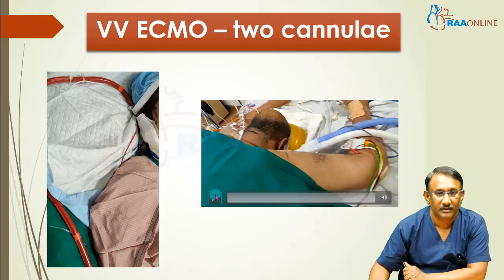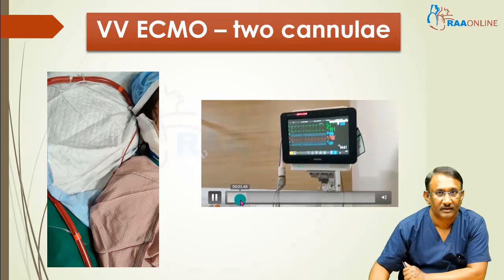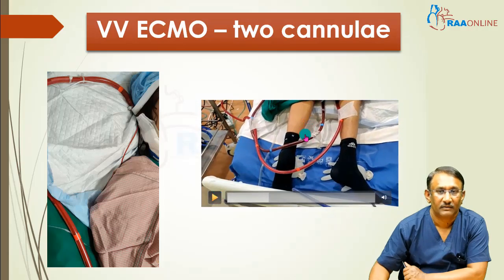This is the other configuration where again you have two separate cannulae, but both are placed through the femoral approach only. There is nothing in the neck. You see that at the leg level you have two cannulae. One femoral vein is used for drainage, the one in the relatively dark color, and after going to the ECMO, the one that comes back is the brighter one. This is through the other femoral vein. So two cannulae, one through the right femoral, the other through the left femoral vein, positioned in the IVC and in the RA respectively, are used for a veno-venous ECMO. This is a fem-fem veno-venous ECMO combination.